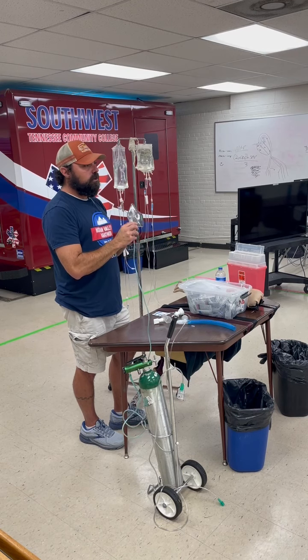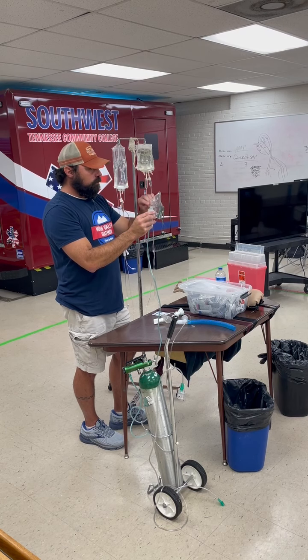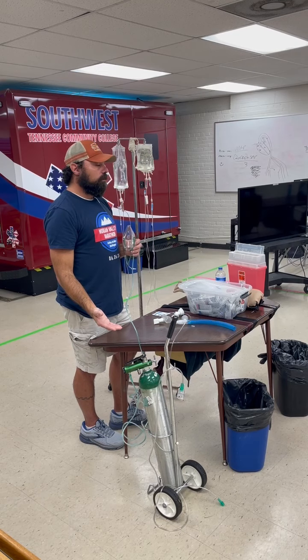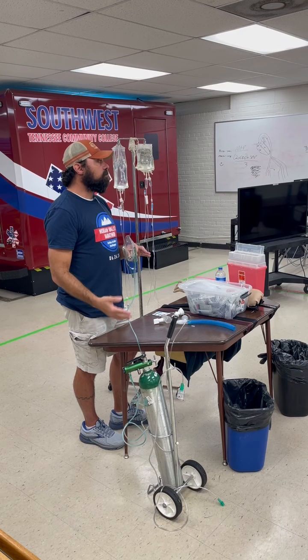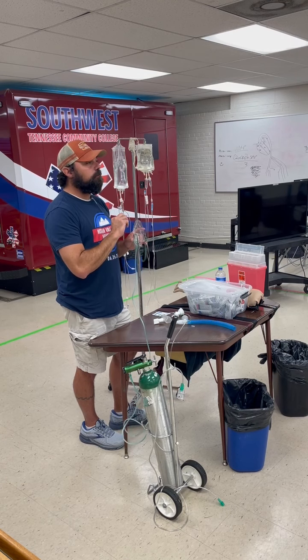I just want to finish with this though. When you guys use this stuff in the scenarios in the lab, I want you to open it. I want you to get used to putting it in there. I want you to recap it. Right now we're out of oxygen on our small bottles, so if you're using a small bottle, you're not going to be able to turn on oxygen. I want you to get the muscle memory.